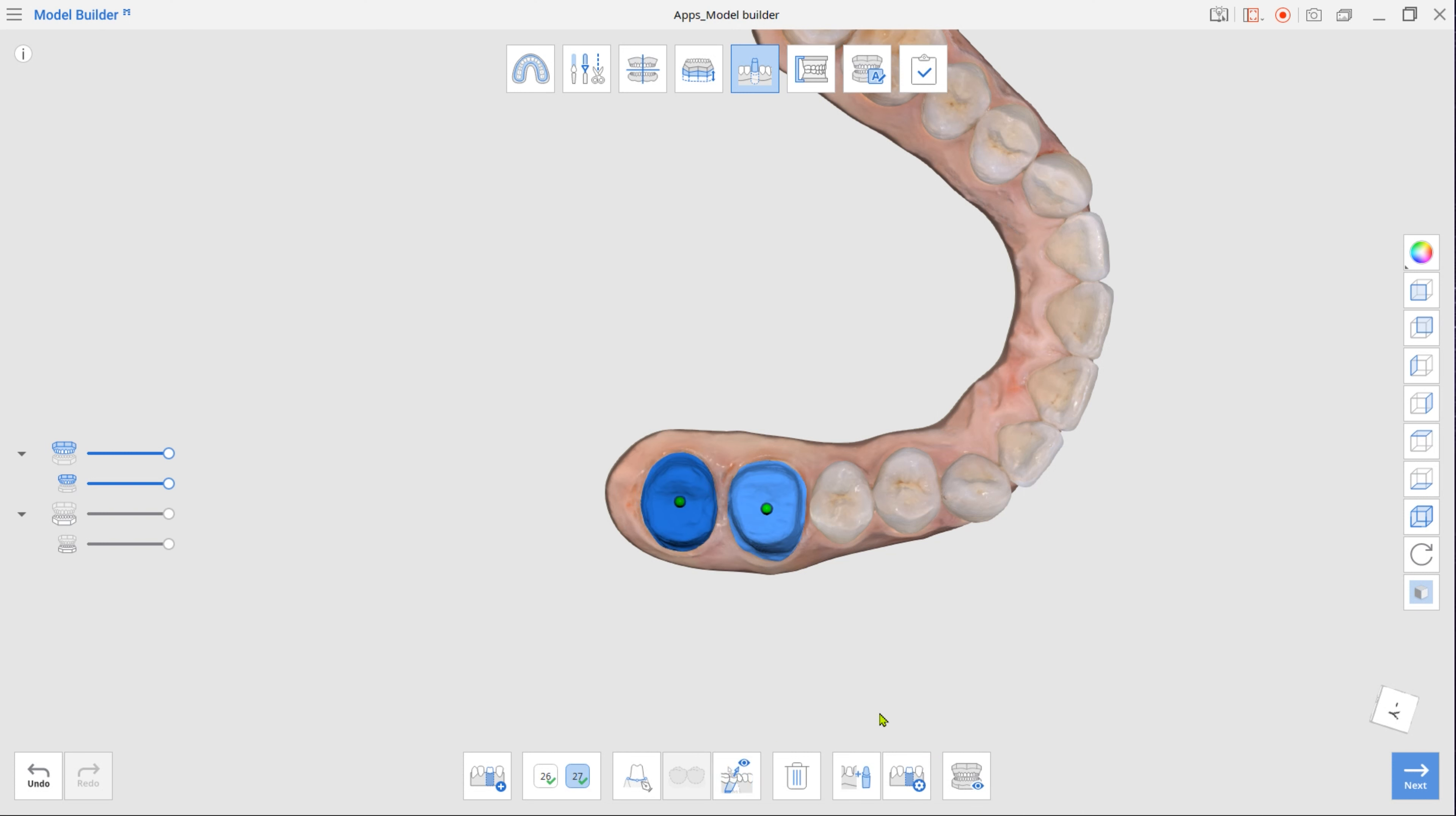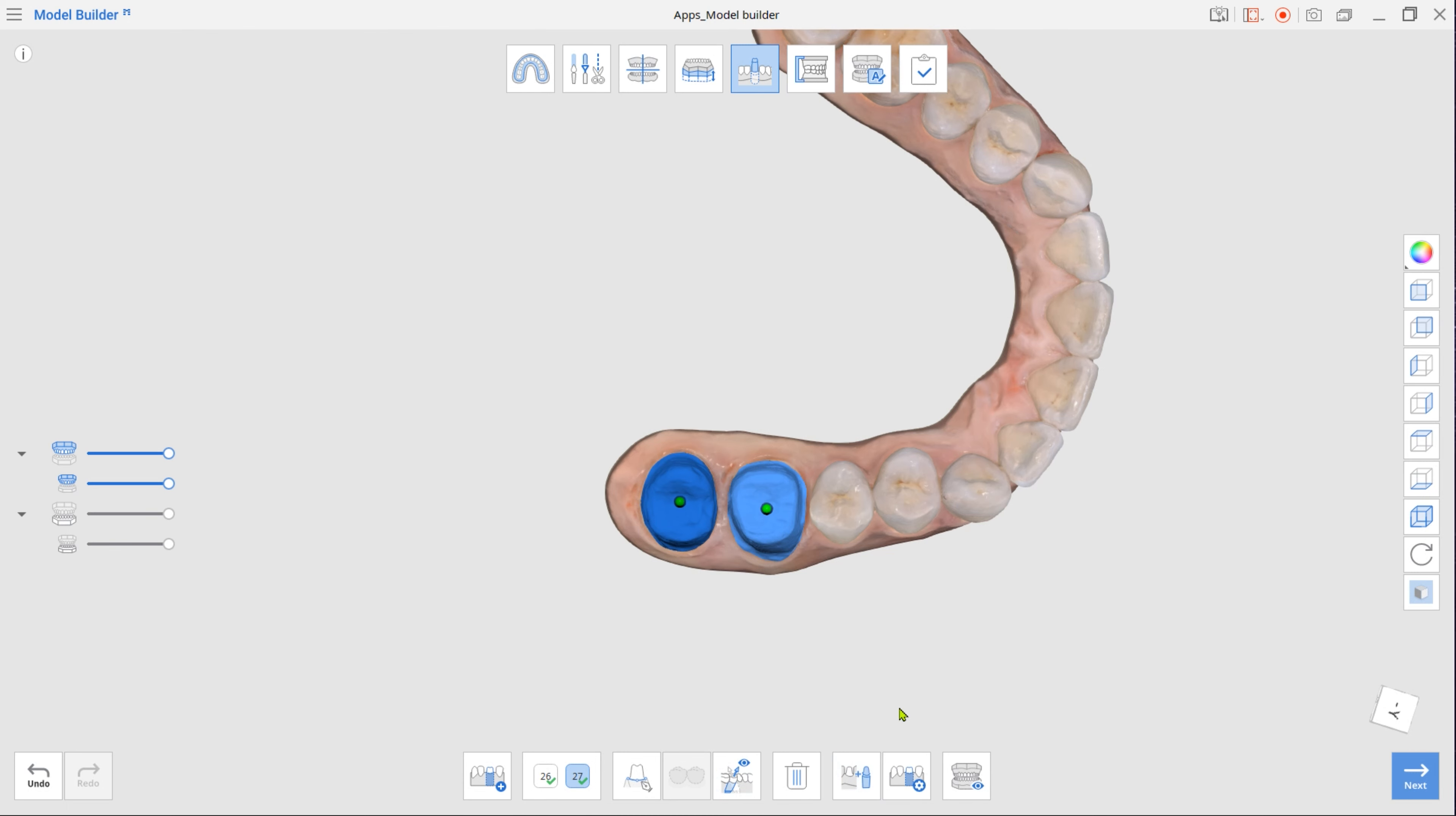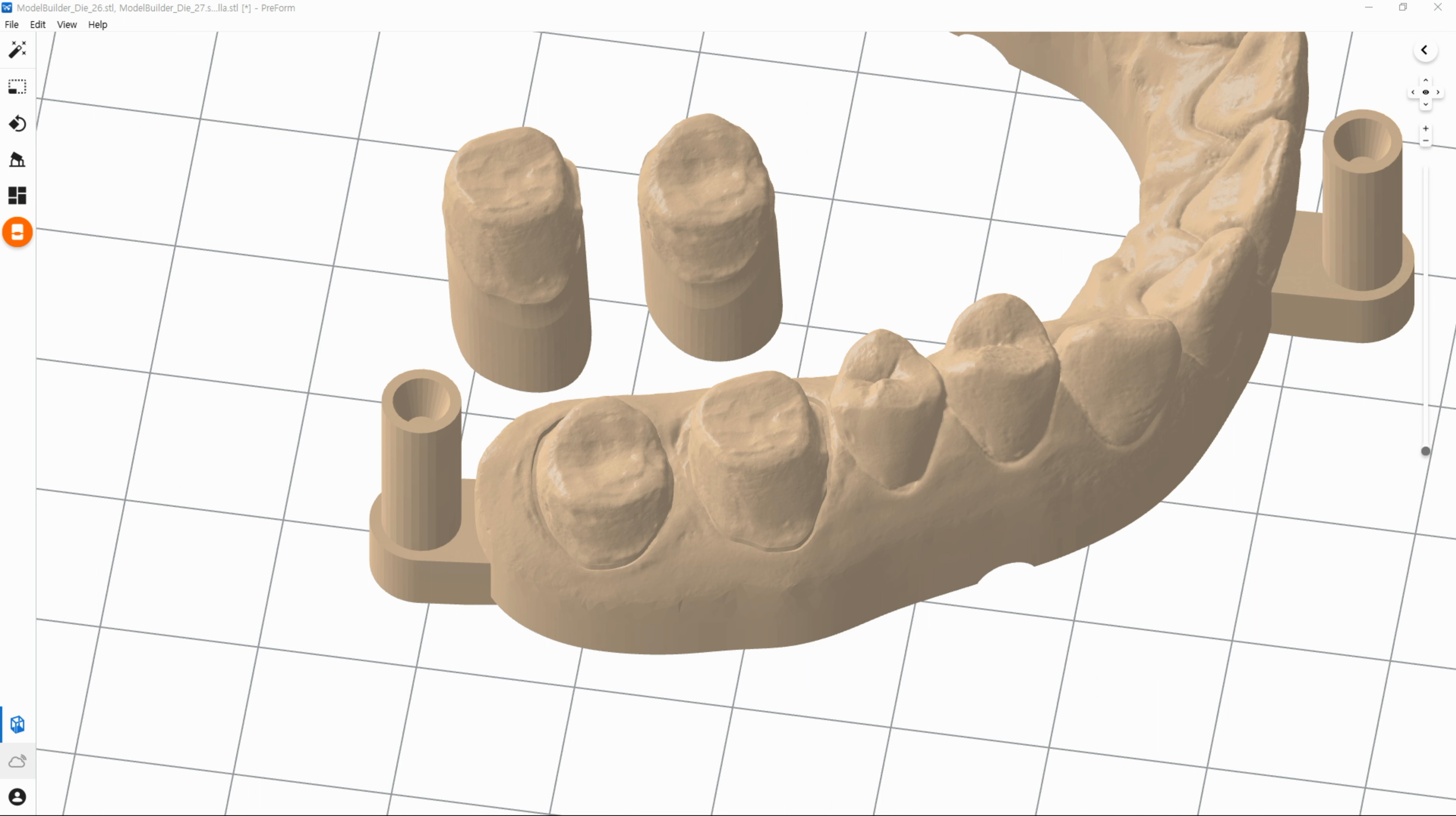To create additional dies, make sure the Extra Dies option is selected in the toolbox. In this case, the prepped teeth in the base will have trimmed margins.